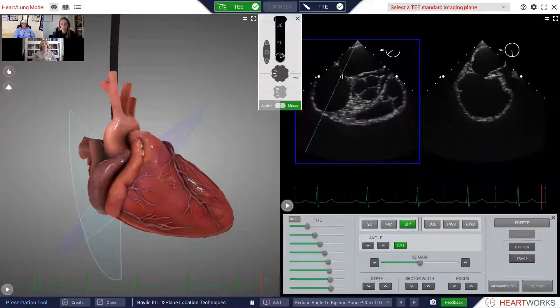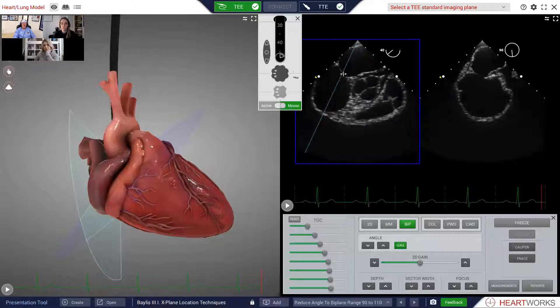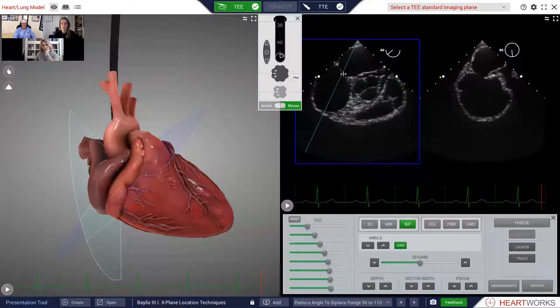Now all of a sudden you'd see it in both views, which is good. The issue of flipping back and forth — which everybody does from view to view — is that the needle can move as you're flipping back and forth. So in a perfect world you would like to see it in both views simultaneously, so that there's no loss of the image of the tenting position. That's why people like to use biplane when they're going transseptal.